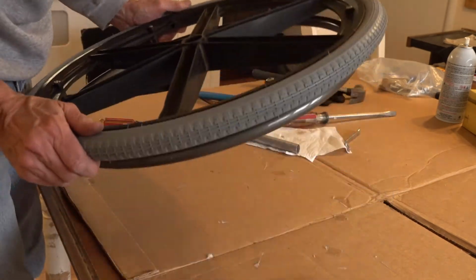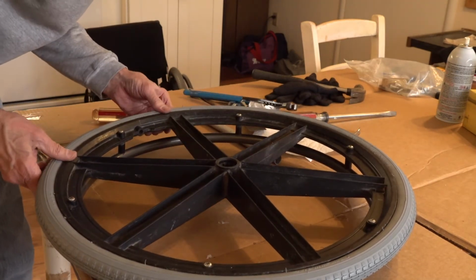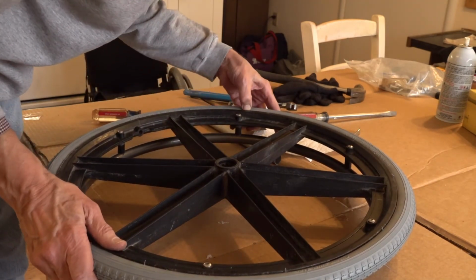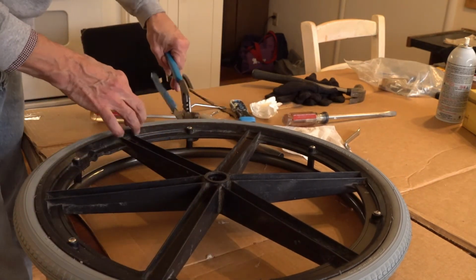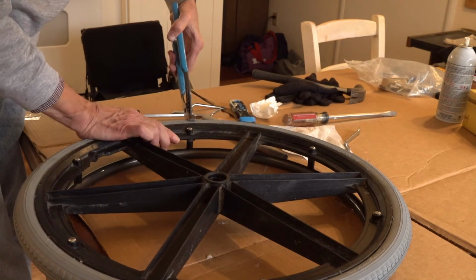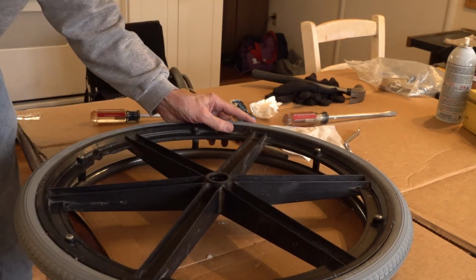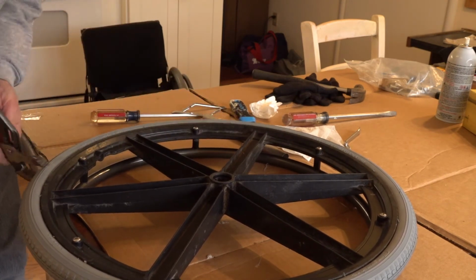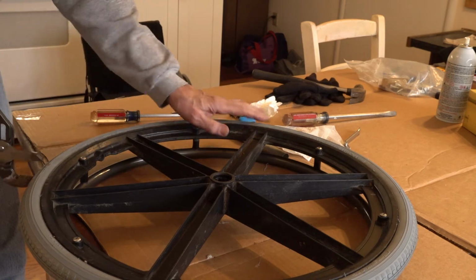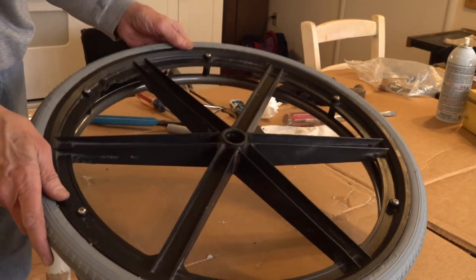Done. Again, I inspect it, make sure it's inserted uniformly. Okay, this one. Not too bad. And we're done.